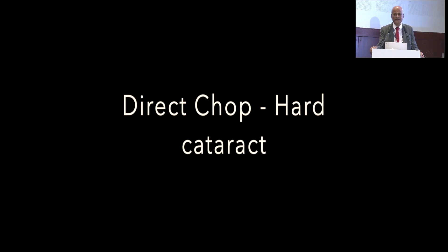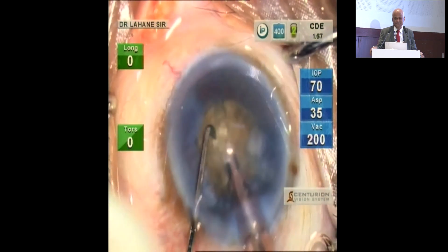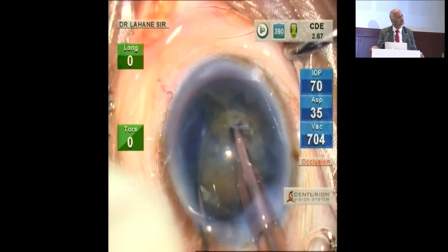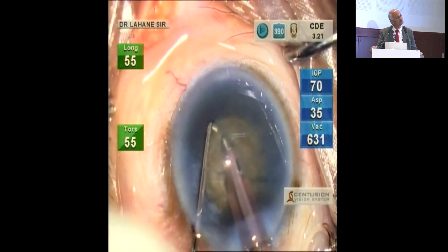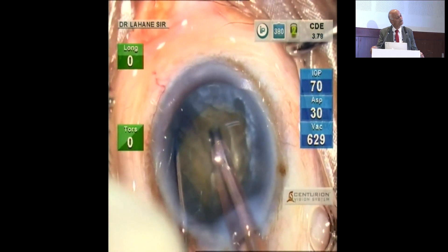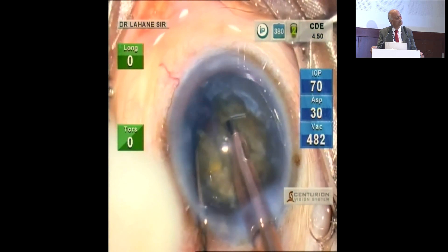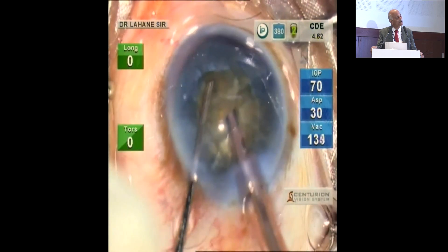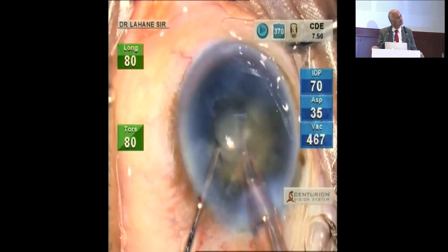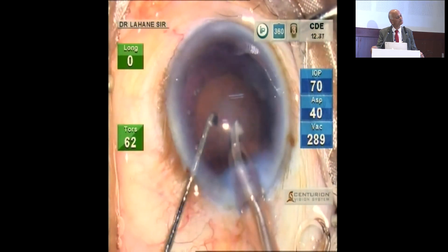Now see the direct chop. Whenever you are doing the direct chop — if there is a whitish element, but if it is a brownish element, don't go for the direct chop. If the cataract is hard with a whitish element, though it is brown, because of the whitish appearance, you can do the chop. See what I am doing: I am separating the piece gradually up to the center of the nucleus. I hold the piece with my faco and separate it with my chopper. You must separate it properly, and once that is separated, emulsifying one piece at a time is not difficult.